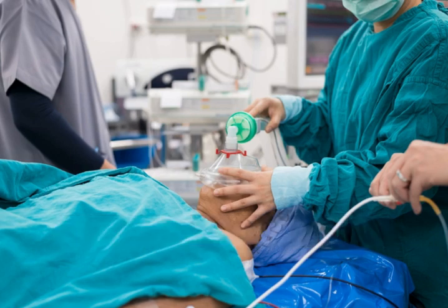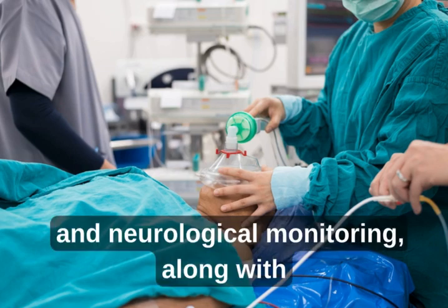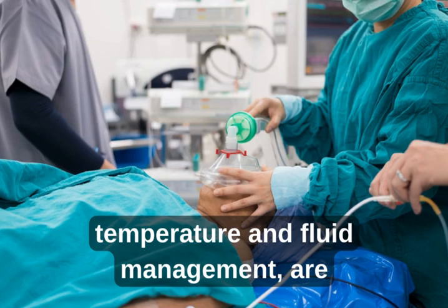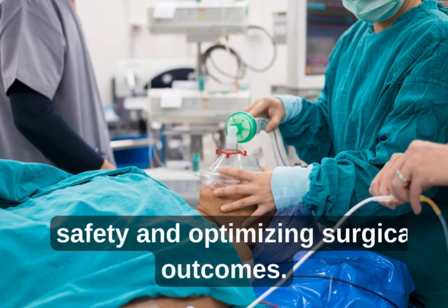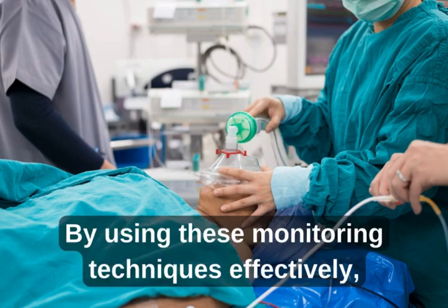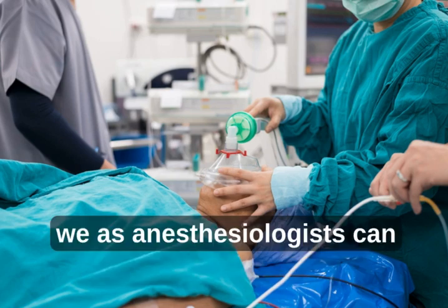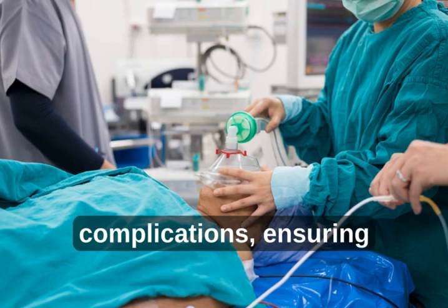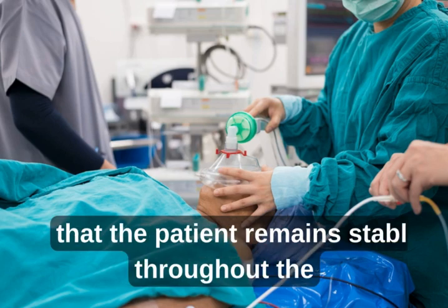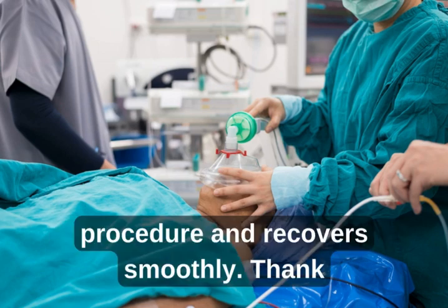Cardiovascular, respiratory, and neurological monitoring, along with temperature and fluid management, are all indispensable for ensuring patient safety and optimizing surgical outcomes. By using these monitoring techniques effectively, we as anesthesiologists can proactively detect and manage potential complications, ensuring that the patient remains stable throughout the procedure and recovers smoothly.